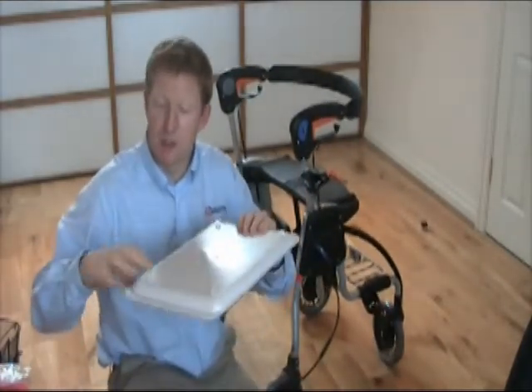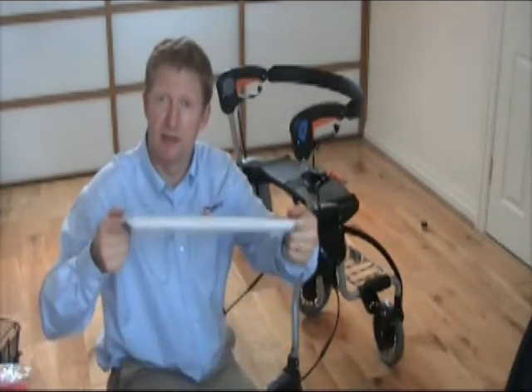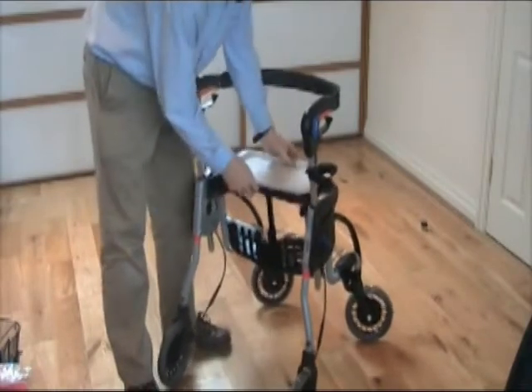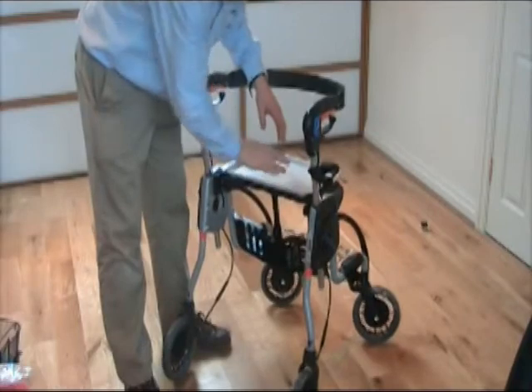It's got two rubber stops on the back side of the tray, and two sort of handles so you can hang onto it from the sides. It fits onto the seat with the rubber stops going on each side of the seat to stop the tray from sliding.